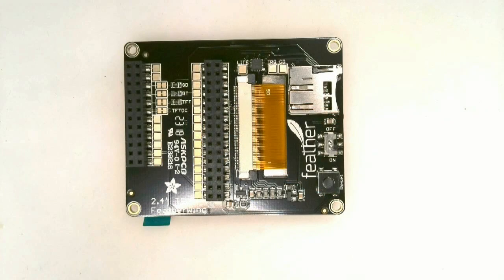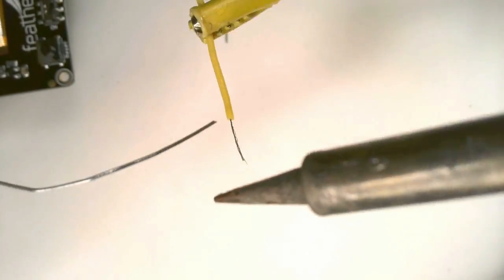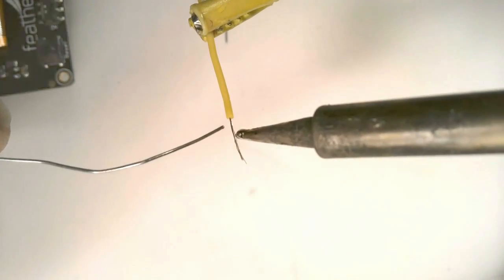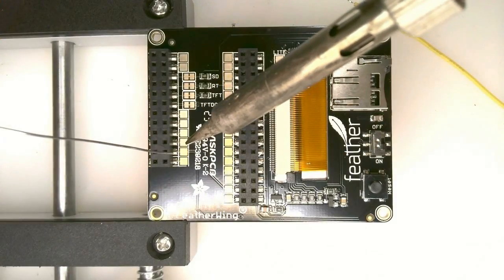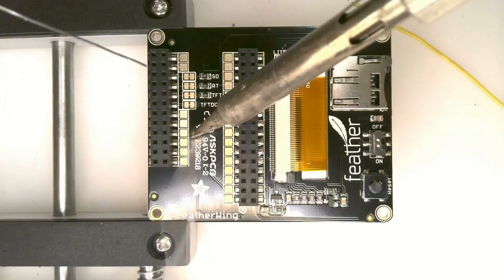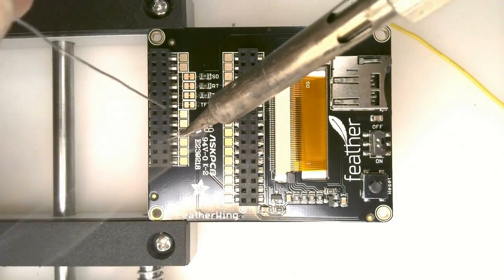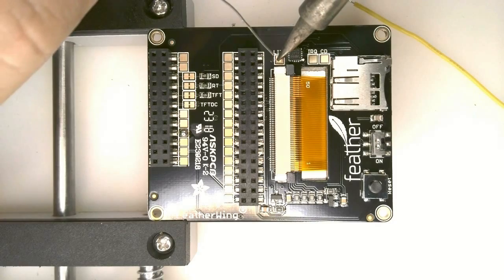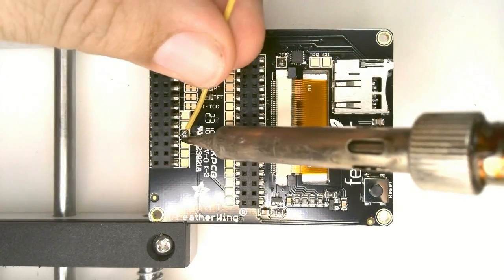Now we turn to the TFT display. You will need 3 wires, a yellow jumper wire, a black ground wire, and a red power wire. You might want to consider using flexible stranded wire with silicone covering because it's a little easier to use in this situation. You should coat the tip of the stranded wire with solder before starting. Put a drop of solder on the pad where the wire is supposed to go. In this case, it's pin 13, and in the upper right, there's a pad that's labeled light. This controls the backlight on the display.